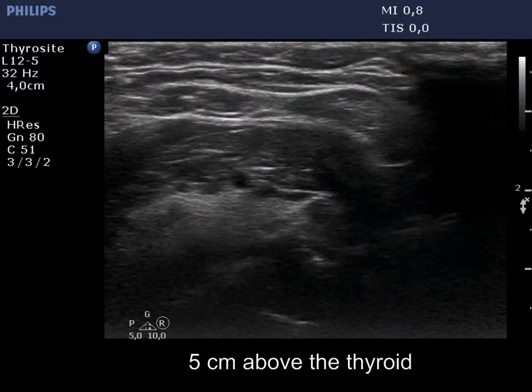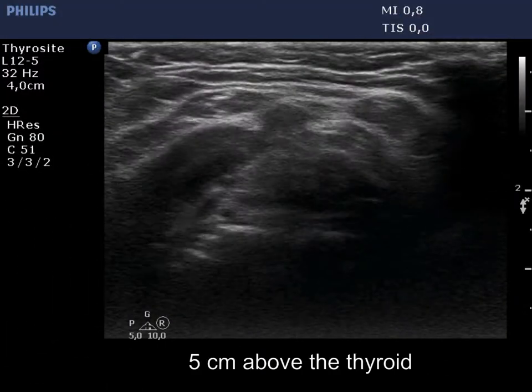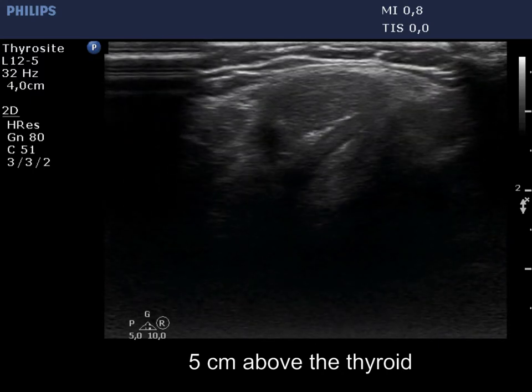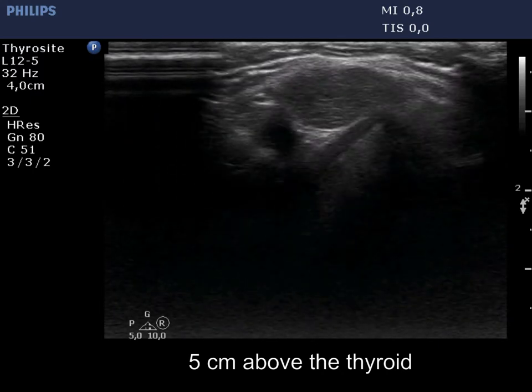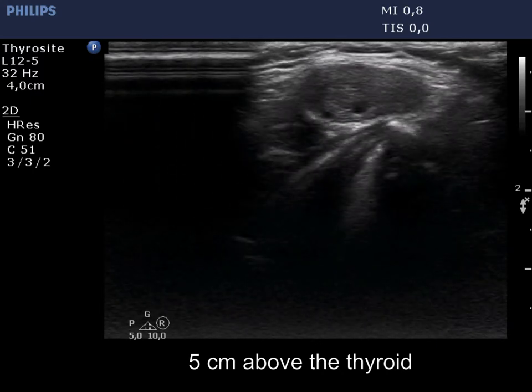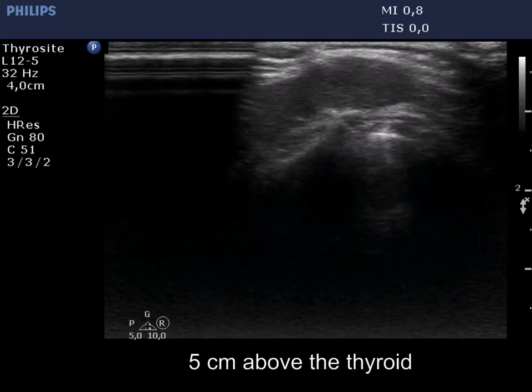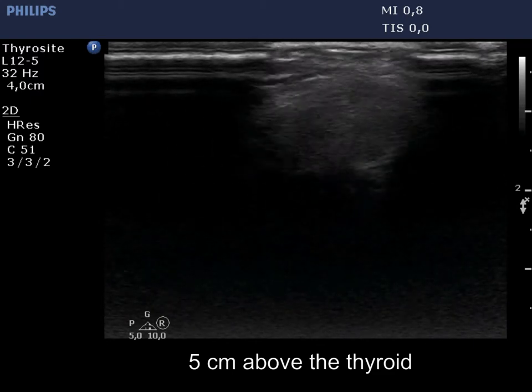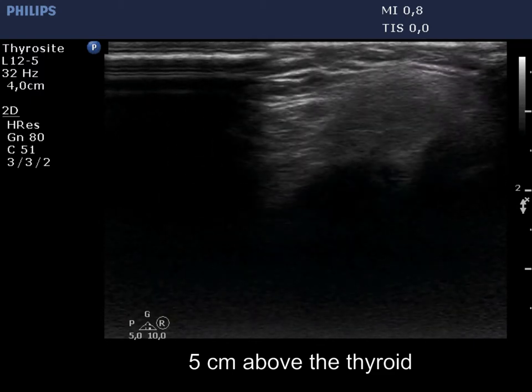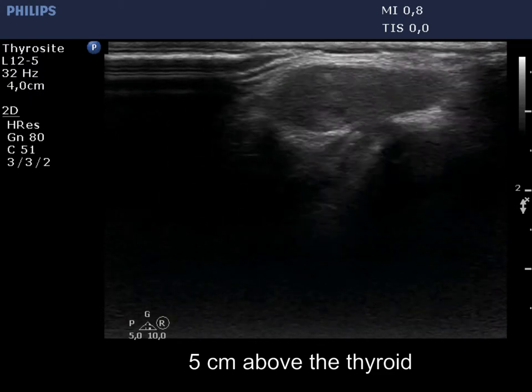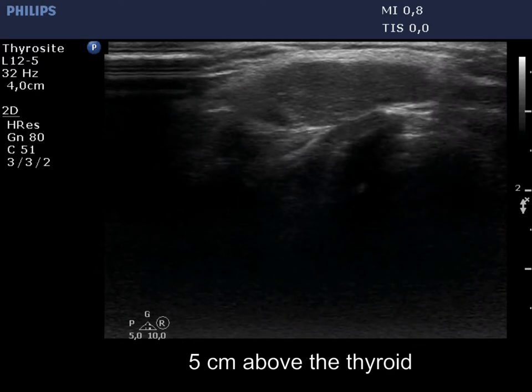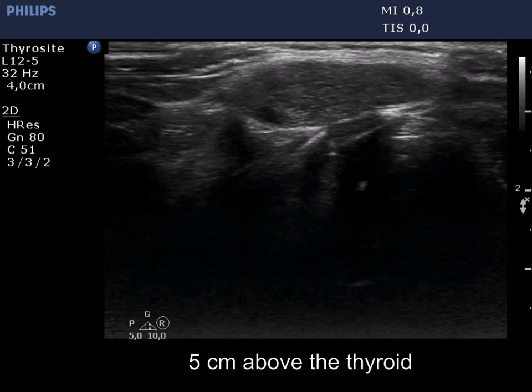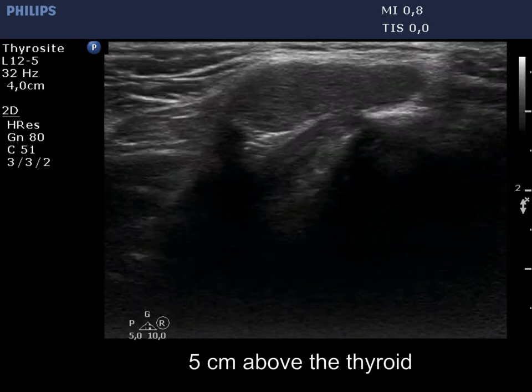Now we are above the thyroid in the middle of the neck. According to the palpable mass, there is a hypoechoic lesion which has an inhomogeneous cystic area in the dorsal part. The aberrant tissue is presented on longitudinal scan.